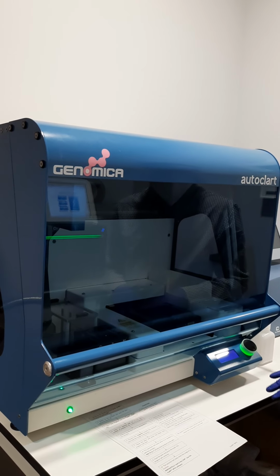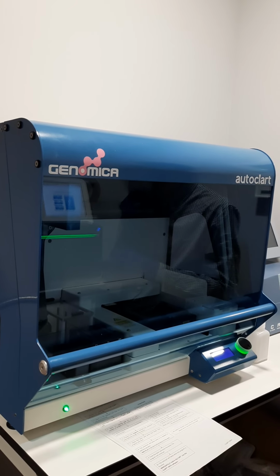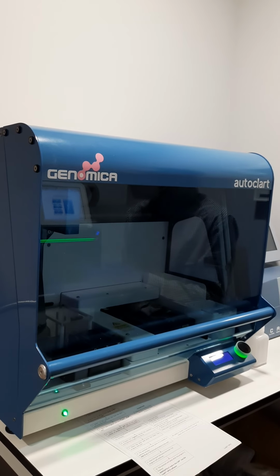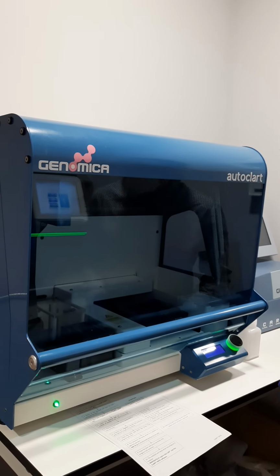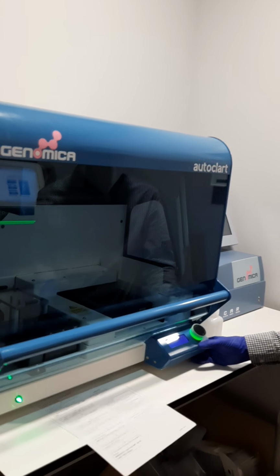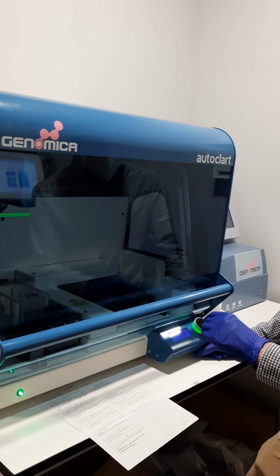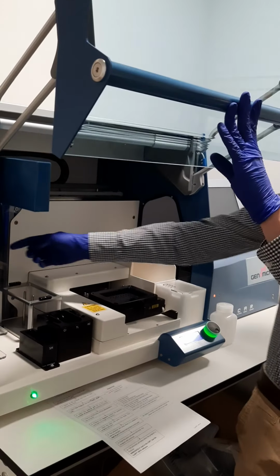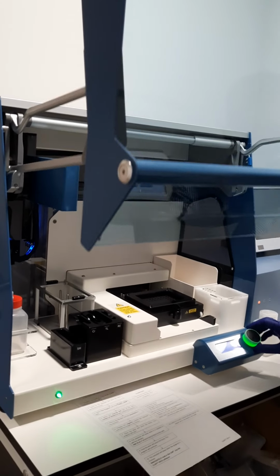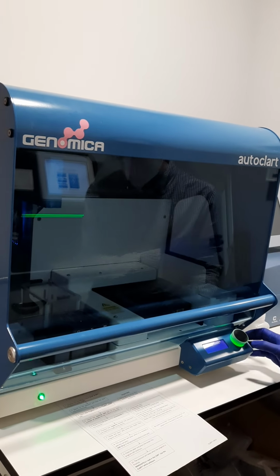So for example, now we are going to use a new strip. We start in A1, but if we have already used 4 wells, we can start in E1 and use the other 4. So we will start in A1, and then we press again, and it's going to ask us about the number of samples. Okay, we have 4 tips, so it's going to be multiples of 4: 4, 8, 12, 16, 20, and up to 96.